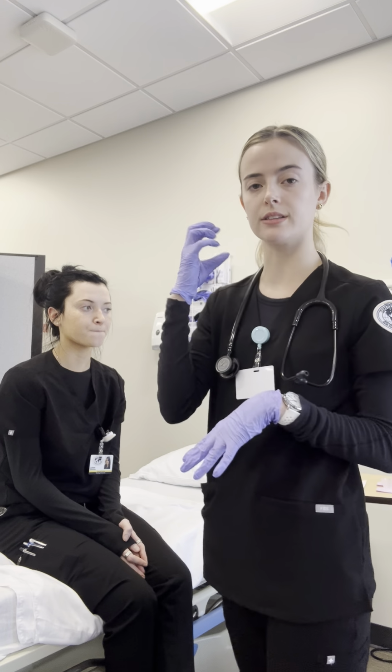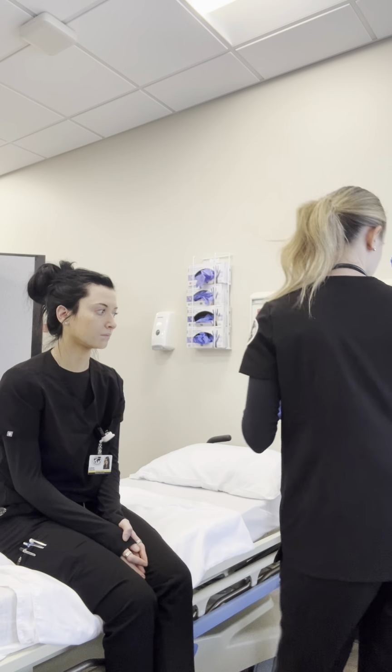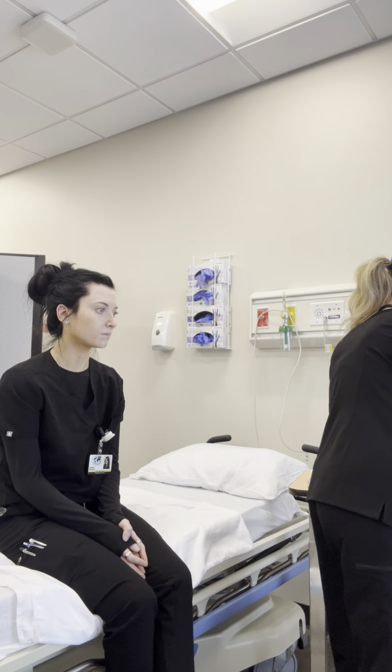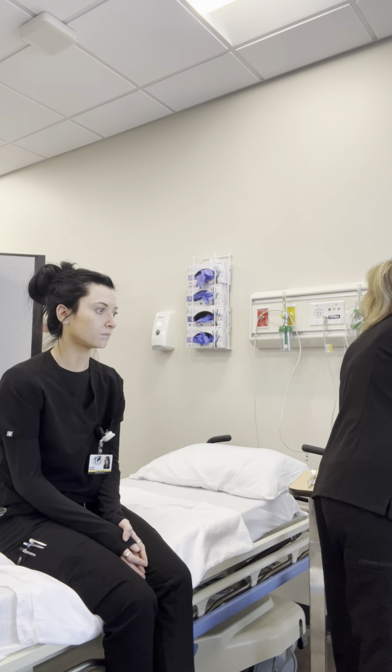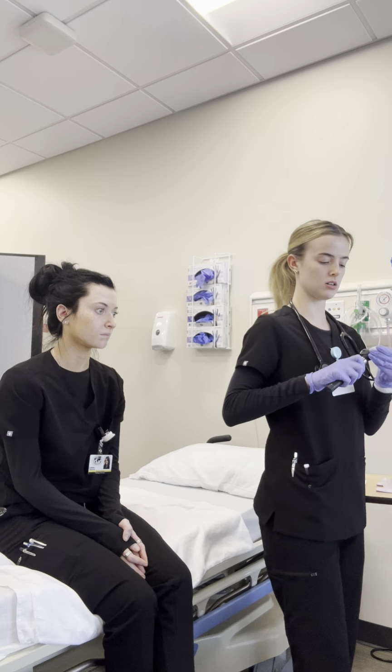Now I want to look at the auditory meatus and the external canal, so I'm going to get my otoscope. Okay, I'm going to clean this off.